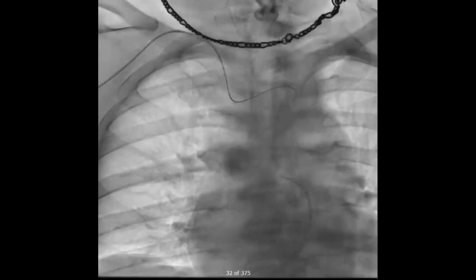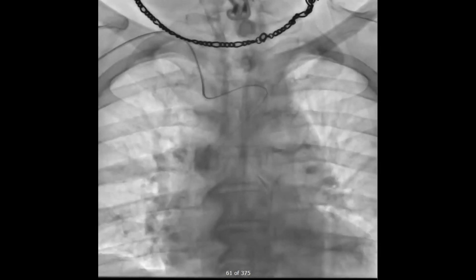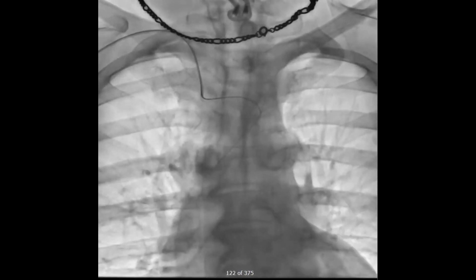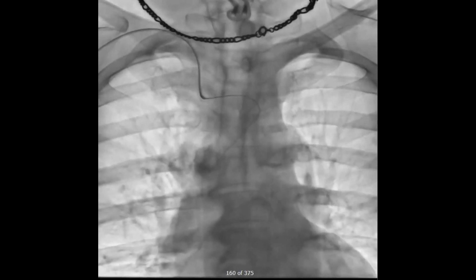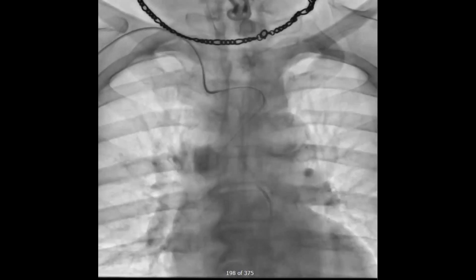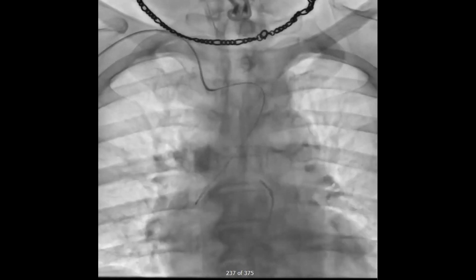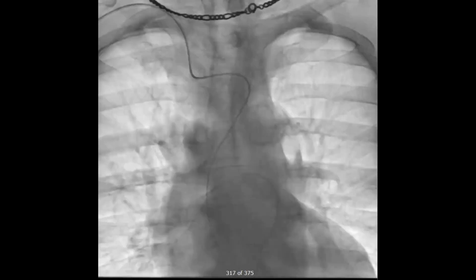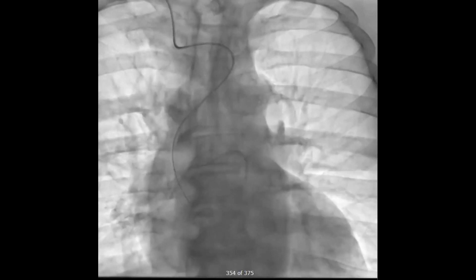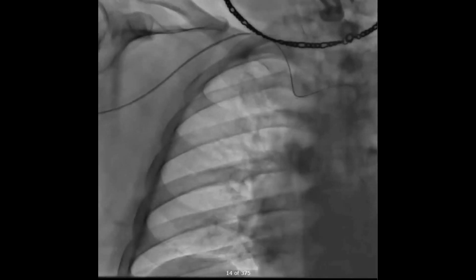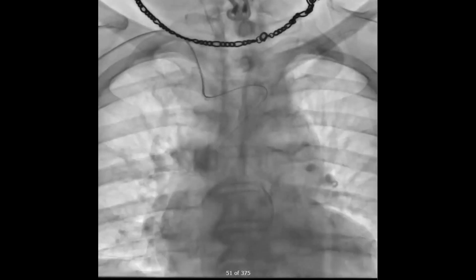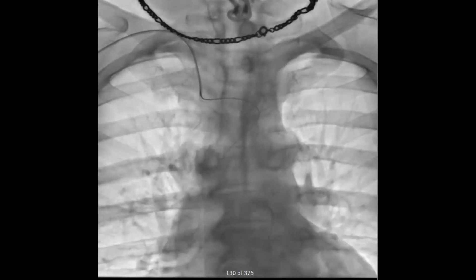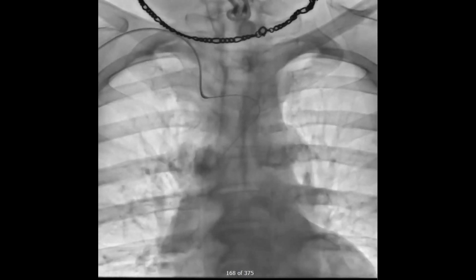This patient is a mid-age patient who needed a pre-TAVR workup with a cardiac catheterization. He had multiple attempts done for engaging that RCA — there was already a diagnosis of anomalous RCA to begin with. They tried from the femoral artery as well as the radial artery. As you can see, we're having a tough time getting the catheters across. The J-wire would not go through, and it was difficult to get it down there.